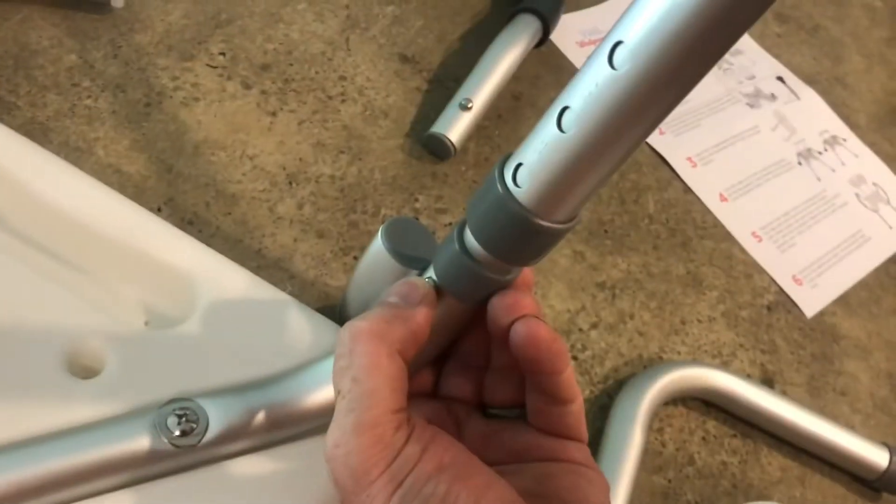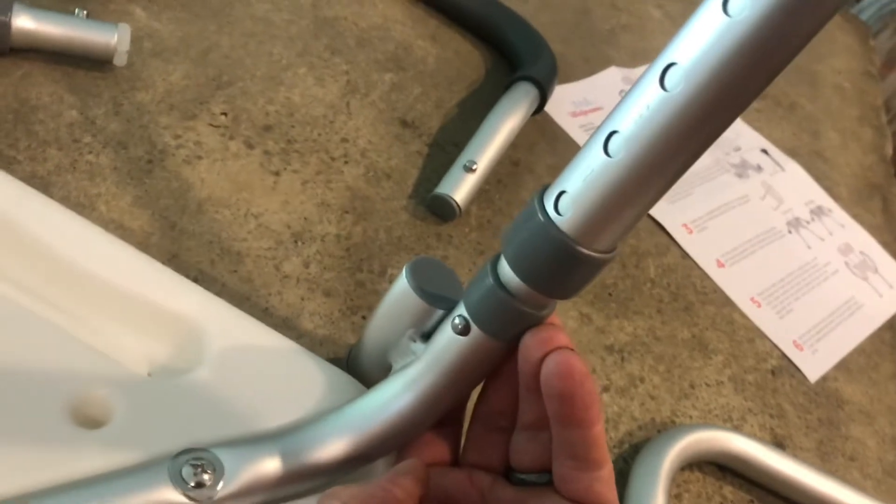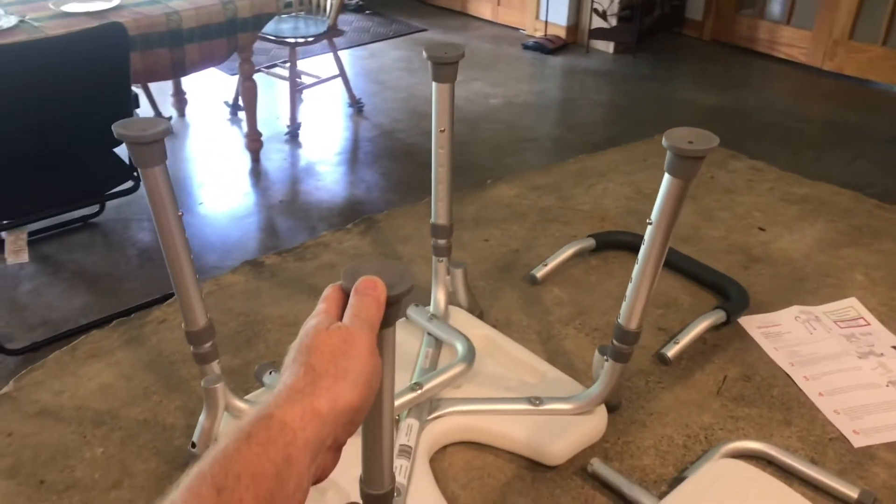You do have to press pretty hard to get these things in. Then align everything to this little nib here. Then put all four legs in the same way — they only go in one direction.